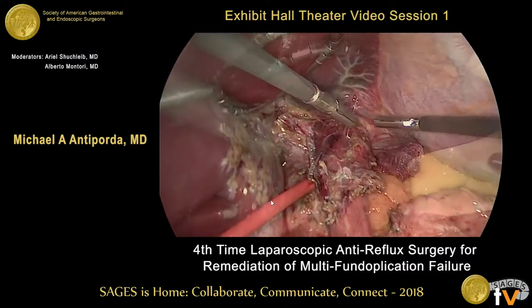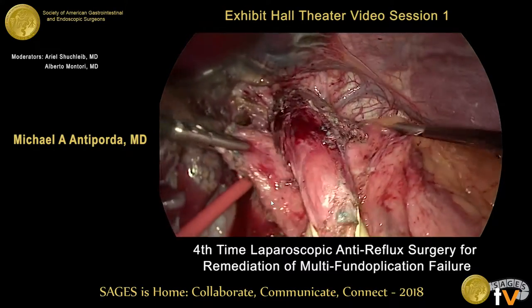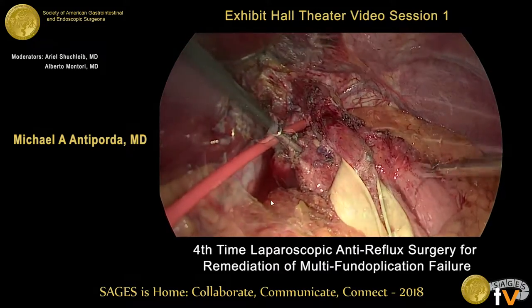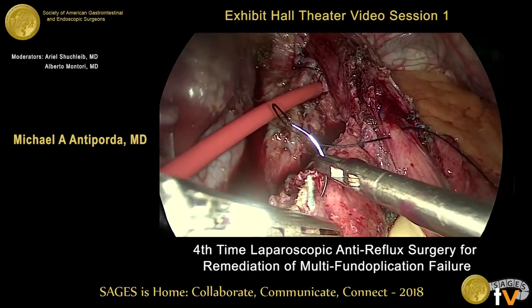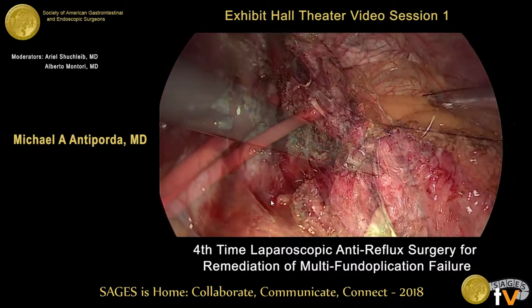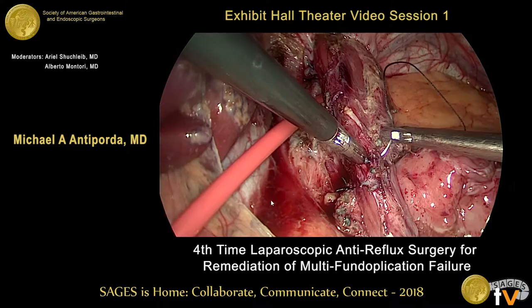Next, the pliability of the stomach tissue is assessed for use in a repeat fundoplication. With a shoeshine maneuver, it becomes apparent that the fundus is too fibrotic to permit a loose 360-degree fundoplication. That, in combination with the preoperative HRM showing a degree of ineffective esophageal motility, we decide that a posterior partial fundoplication would be best for this patient. We therefore perform a Toupet fundoplication using three sutures of zero silk for each pillar of the wrap.